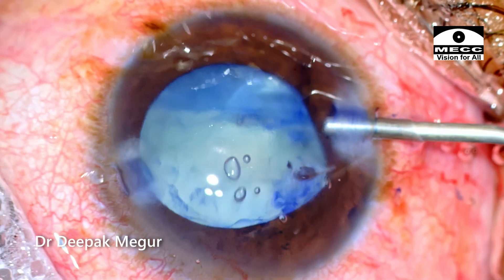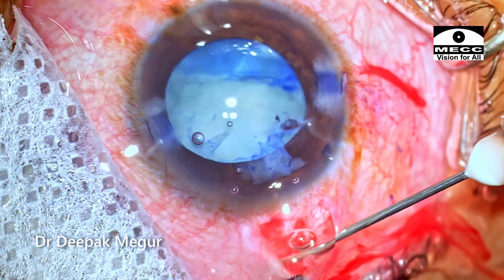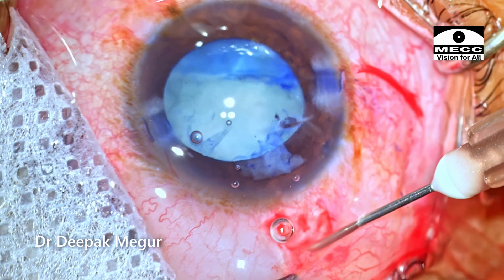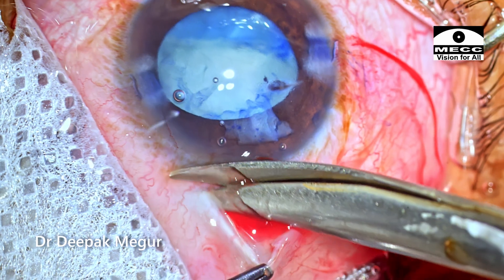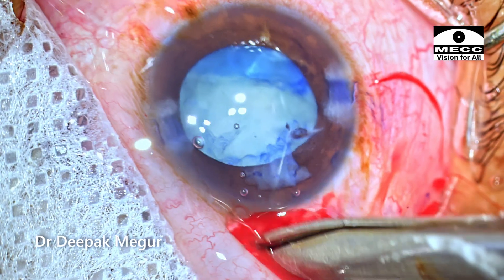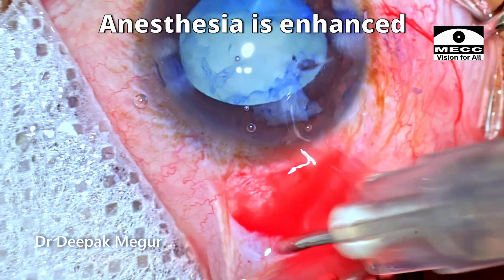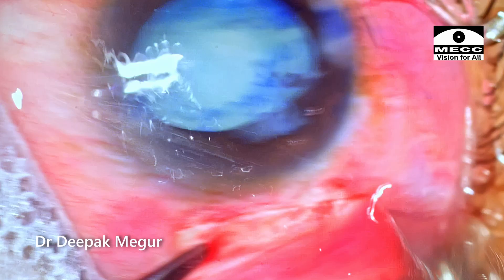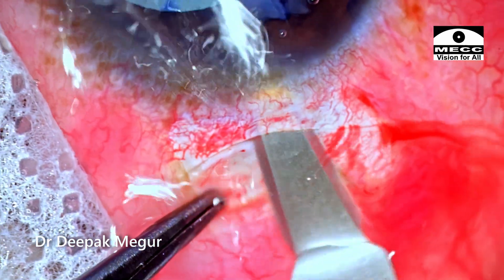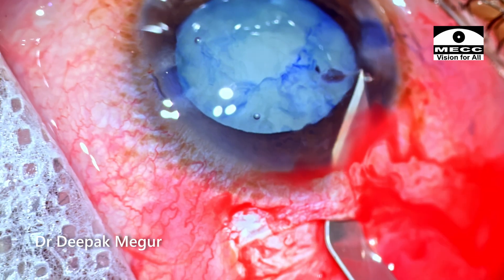I realize there's something fishy. There must be a formed nucleus as well. But apart from that, I was very suspicious that a pre-existing PC tear with vitreous disturbance could be present, which is preventing the free flow of this lens matter. Since I'm unable to judge the density of the nucleus and with a strong possibility of an underlying pre-existing PC tear, I decide to create a scleral tunnel so that I can manually express out the nucleus and lens matter, and then reassess the situation.